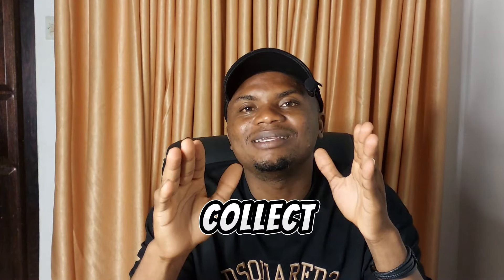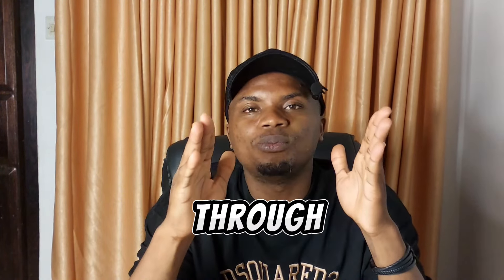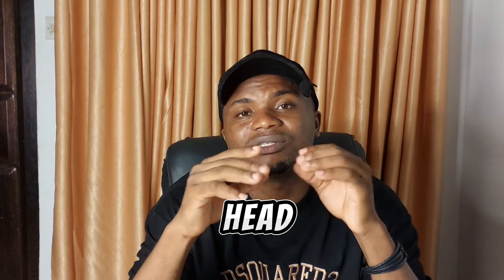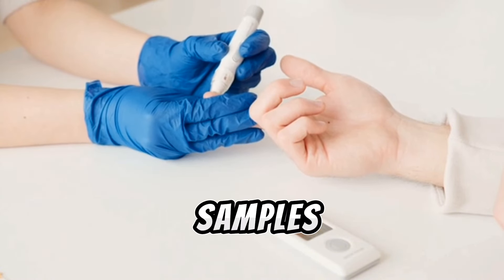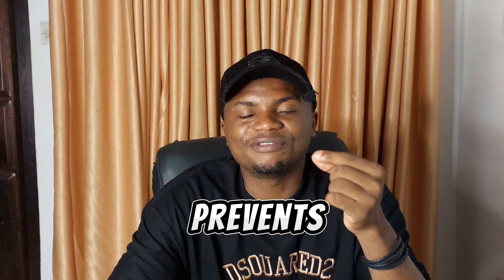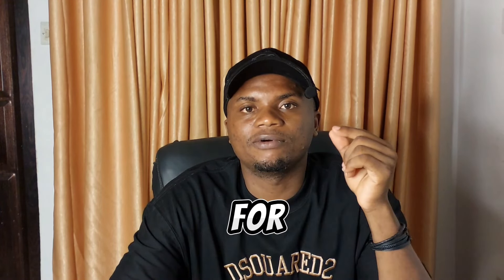There are two ways you can collect a DNA sample for a paternity test. One is through blood sample, and the second one is through cheek swab, which is what we'll be focusing on today. For blood sample collection, the samples of the alleged father and the child are collected using a vacutainer tube that contains EDTA, which prevents the blood from clotting, and these samples are sent to the laboratory for analysis.